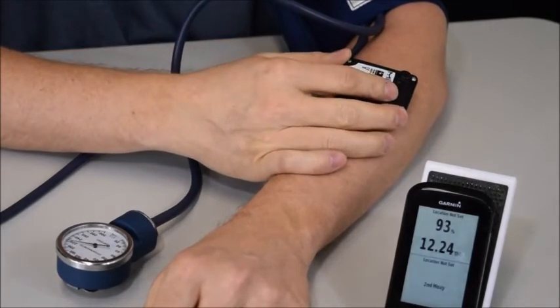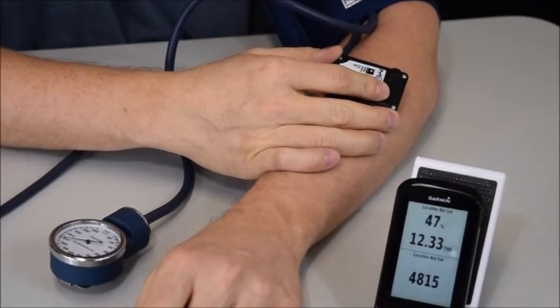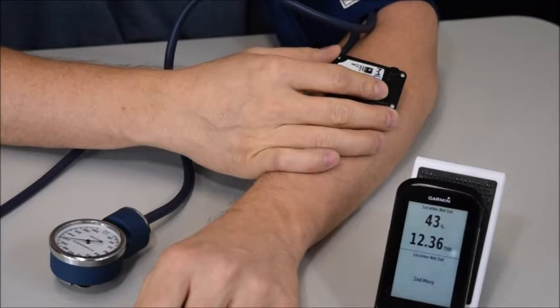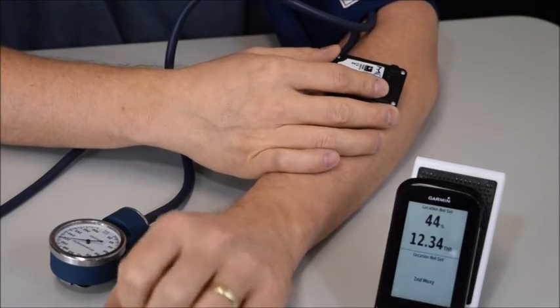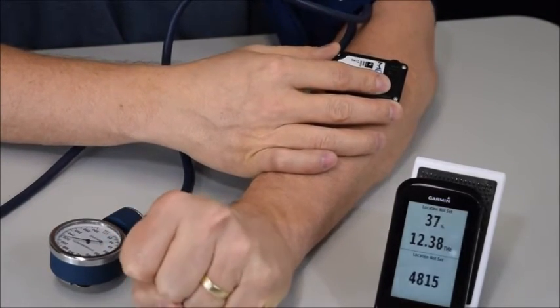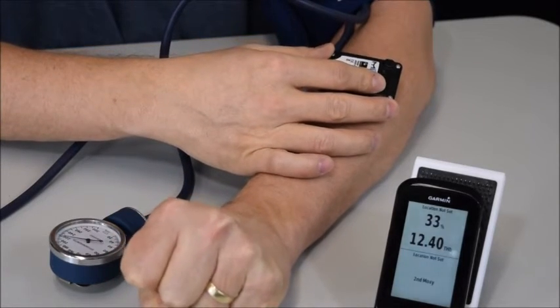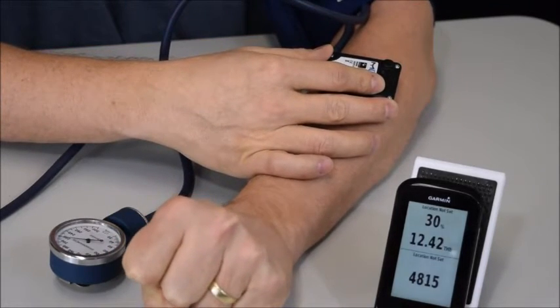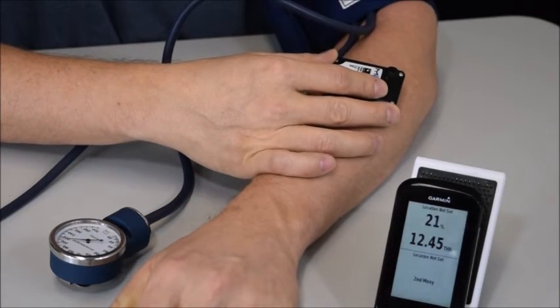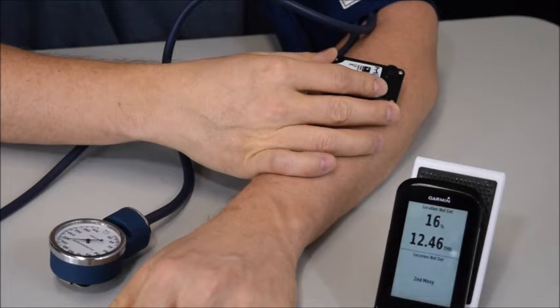And I'll put the Moxie on, and we can see the SmO2 trending down as the muscle is still consuming oxygen, but we've really stopped off the blood flow. And I'm going to tense up a little bit here just to make it use a little more oxygen so things go a little faster. You can see the SmO2 is trending down. Now, in this occlusion case, we would expect to see the SmO2 get really close to zero because we've completely stopped blood flow, but the muscle is still consuming oxygen.